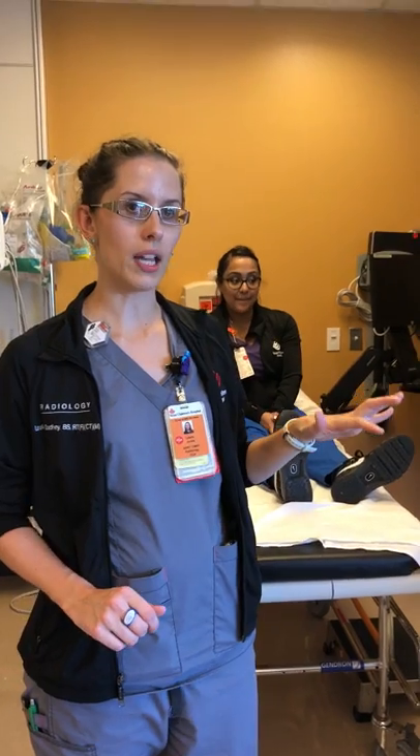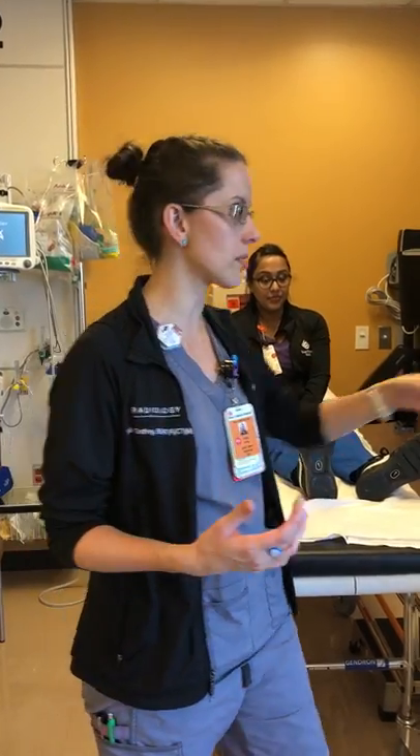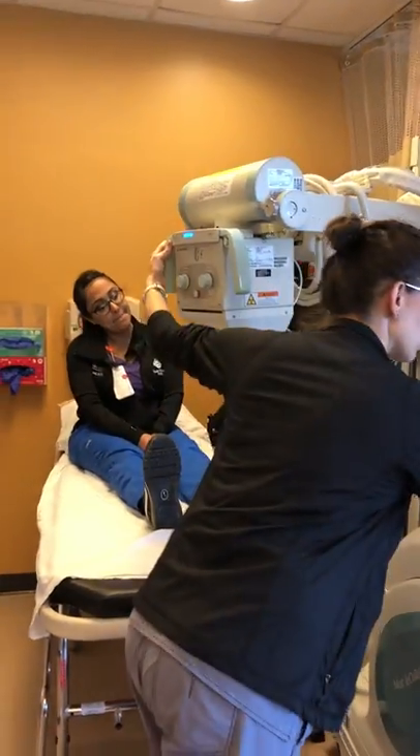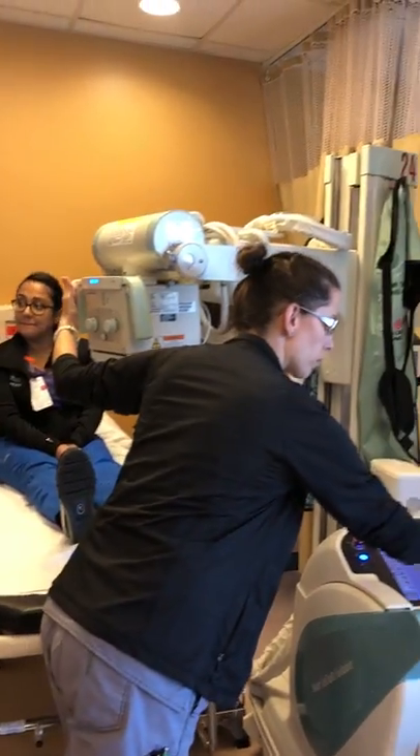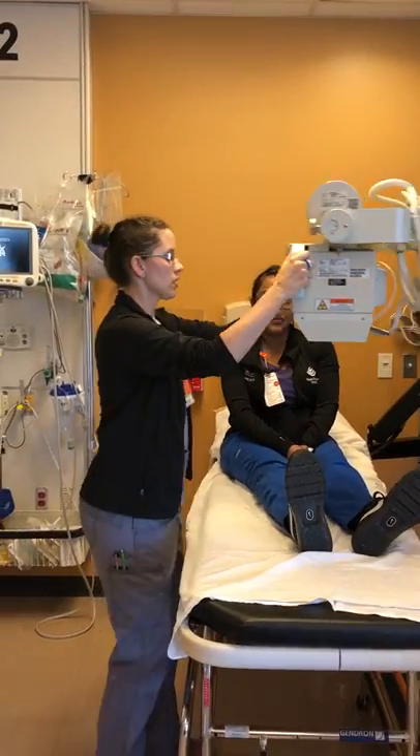If you are in limited space, you can modify what we're going to show you today to the space potential that you have, to maximize the images that you obtain. We're going to assume you have already pulled up your patient, so we're in the positioning stage at this point.